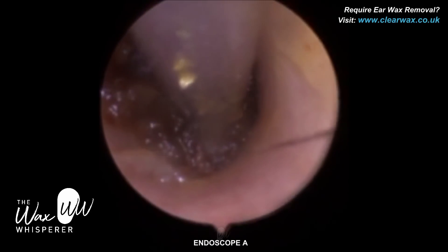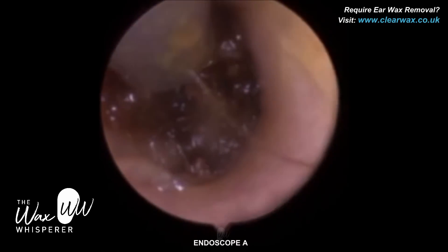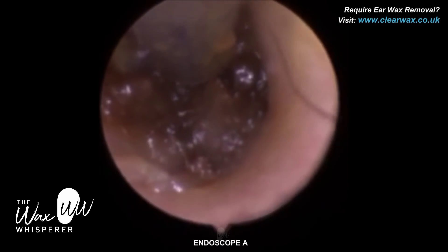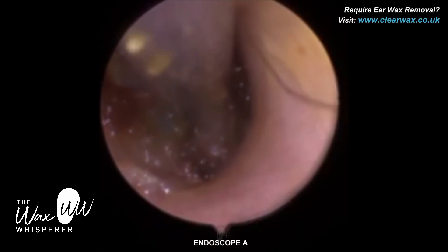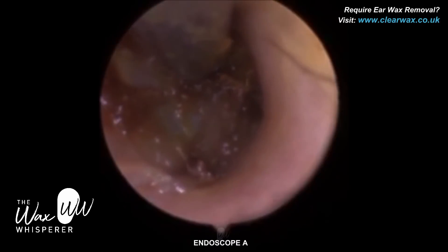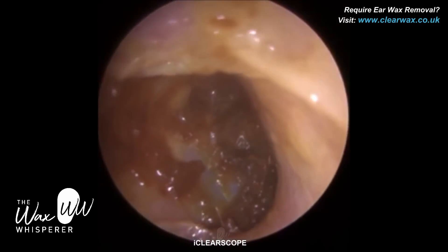However, you can see the negatives of this particular endoscope now. Because it's shorter, I can't insert it further — I'm really battling to get the view I want of the eardrum. At the moment it's a bit blurry. I know the eardrum's just there; I can see a hint of blue. I actually had to stop the procedure — I didn't feel safe continuing.